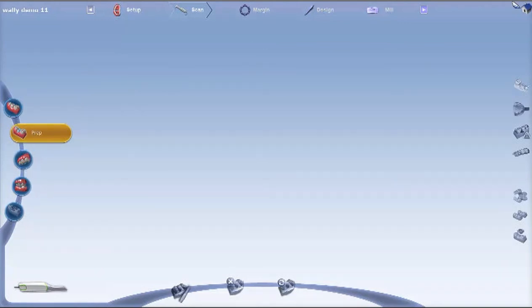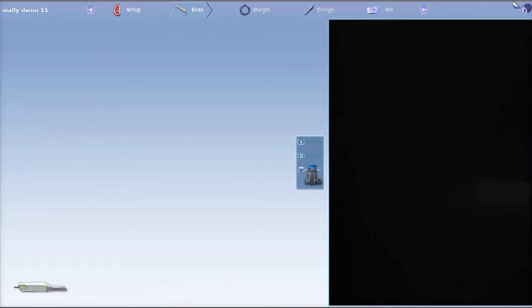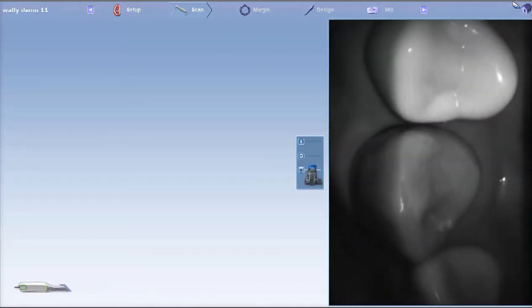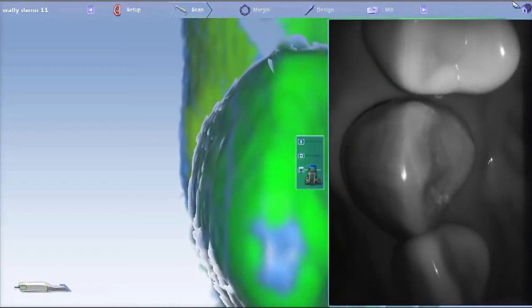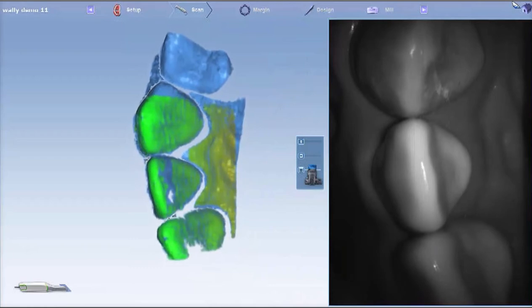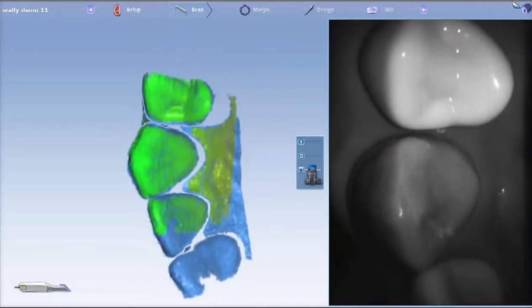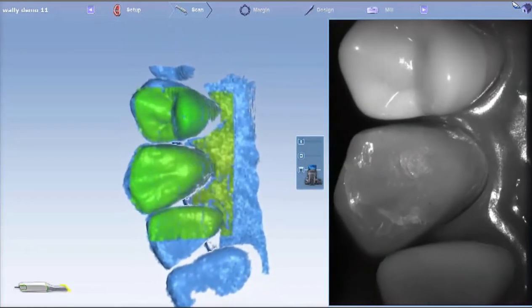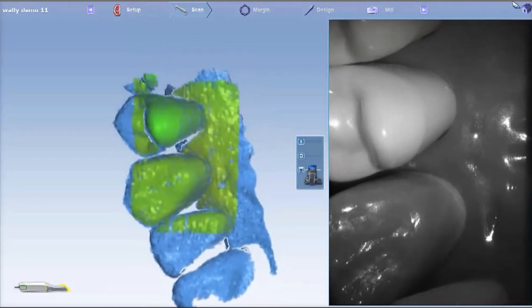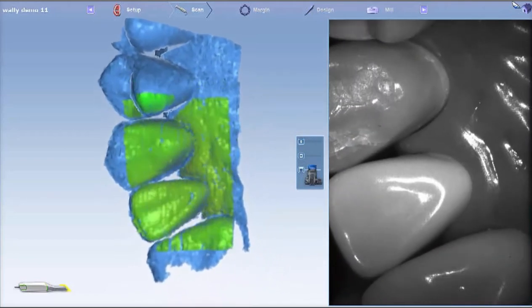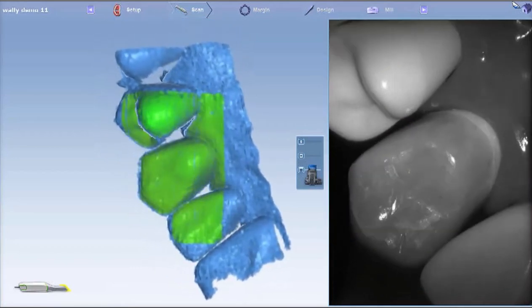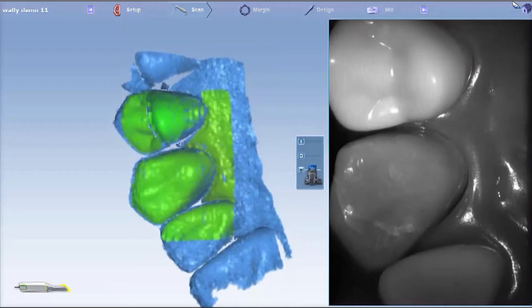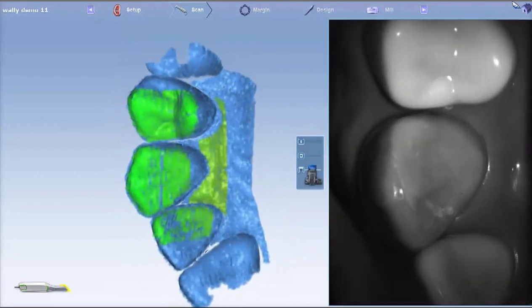For good scanning, it's essential to come from an occlusal or incisal straight-down view when you're first starting to scan. Let it get a little bit, then you can start doing your rotations after you have some of that straight-down incisal view. Here we're going to a lingual roll. I like to roll to the lingual first, then a gentle roll to the buccal.